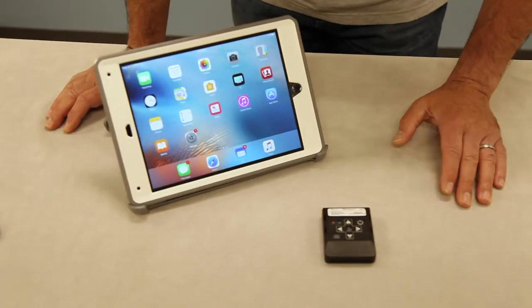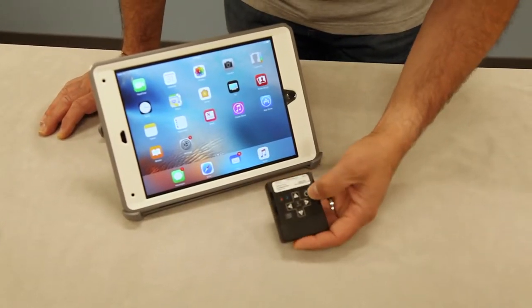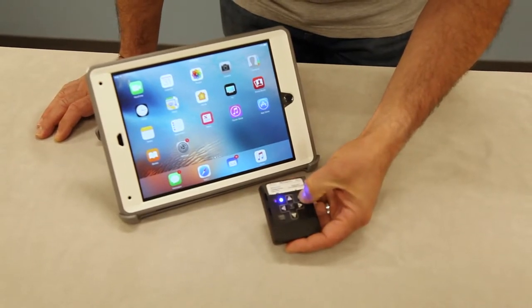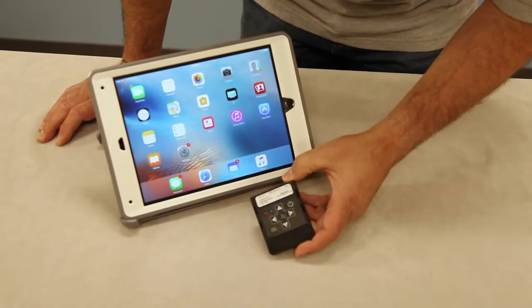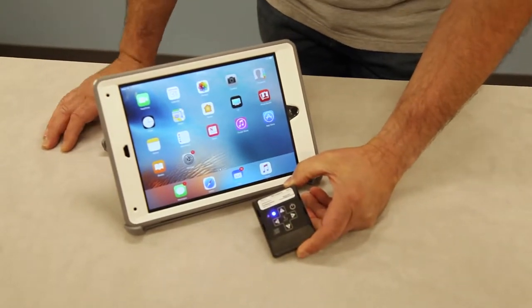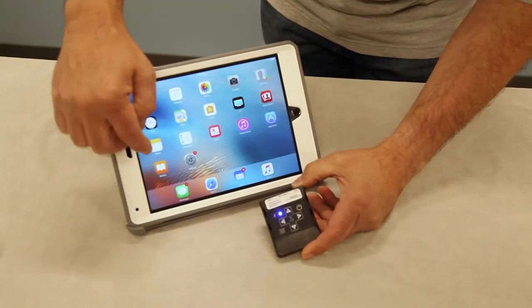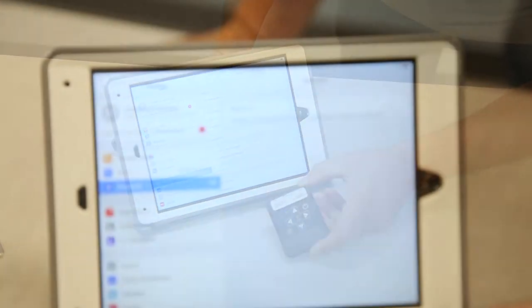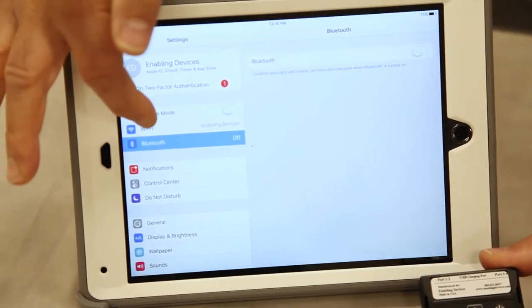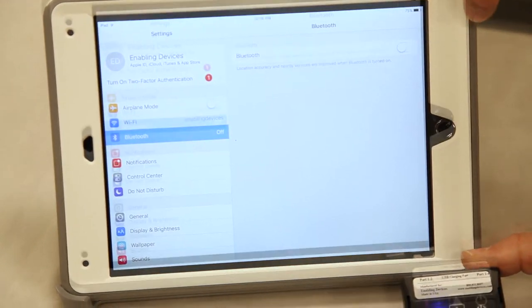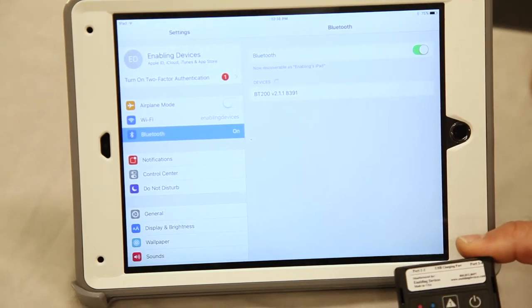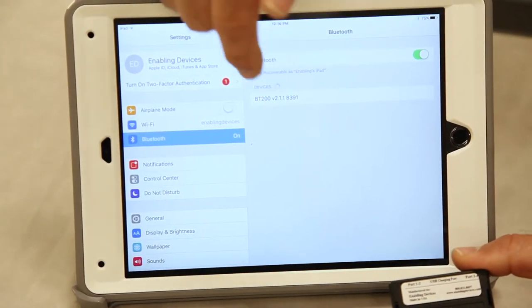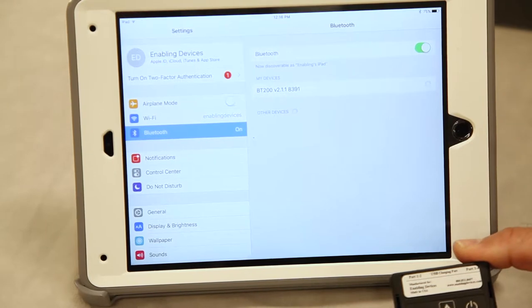The first thing you want to do is power up your interface. Press the power button. It's going to start flashing blue to indicate that it's powered up. And then on your iPad you want to go over to your settings. So the next thing you want to do is go to Bluetooth and make sure it's turned on. And then it'll come up here as a discoverable device.